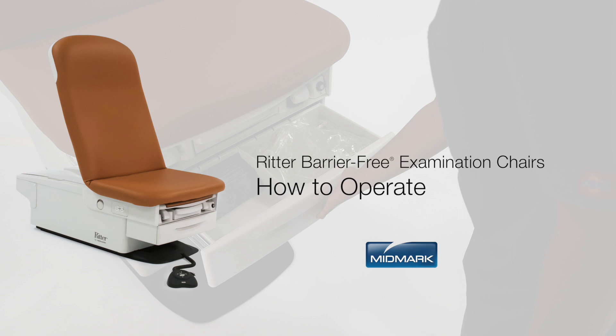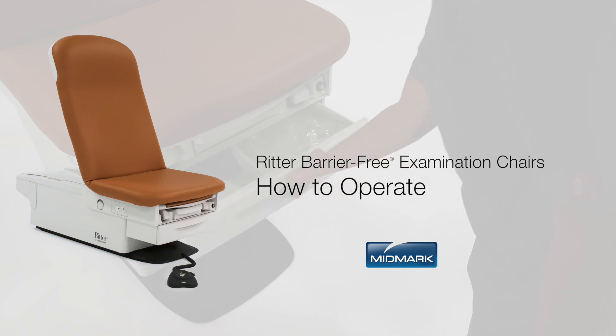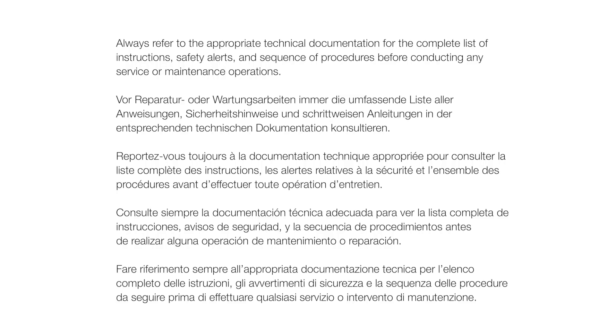This video is an overview of the operation of Ritter Barrier-Free Examination Chairs by Midmark. Always refer to the appropriate technical documentation for the complete list of instructions, safety alerts, and sequence of procedures before conducting any service or maintenance operations.